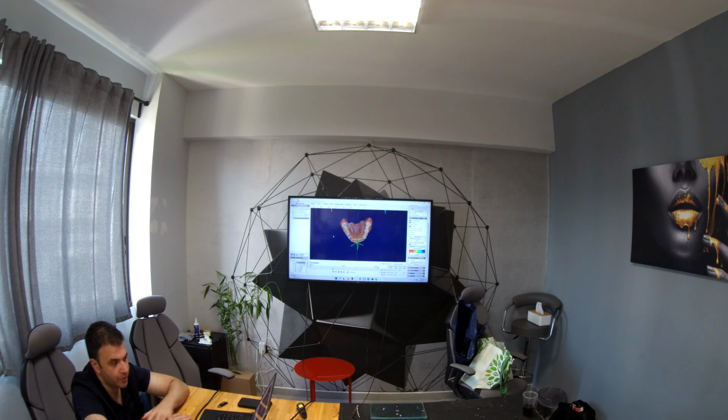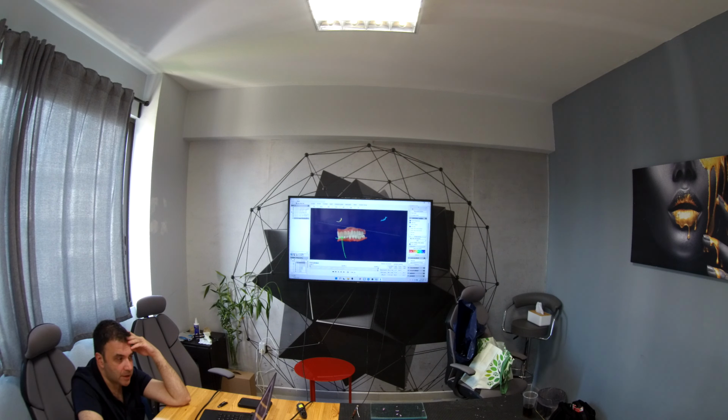She opened her mouth. There was contact here, but it appeared later. You have seen? Once again, contact that appeared later, and not a very tough contact. Because I already saw that, look, this is a position I can just find here.